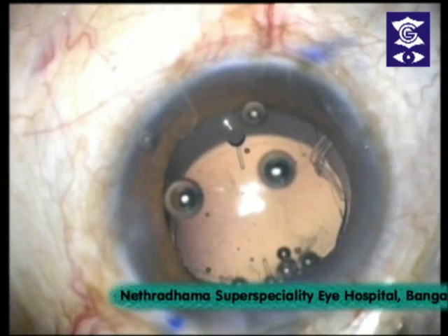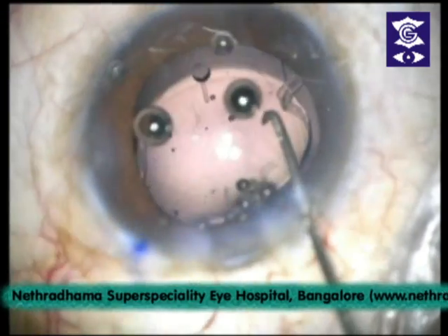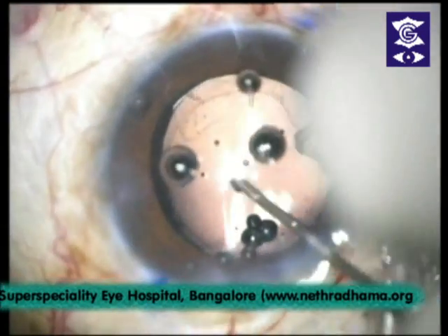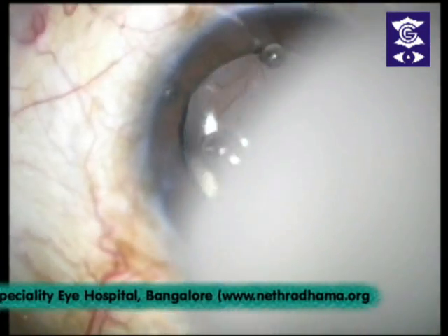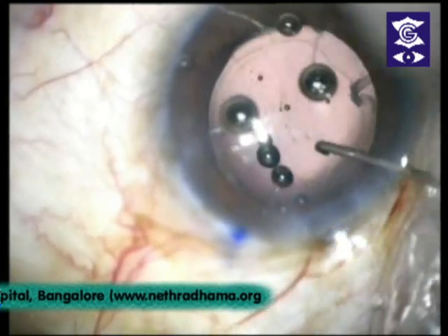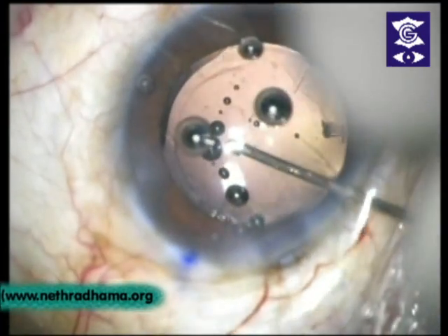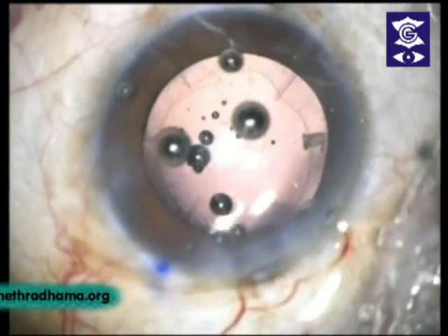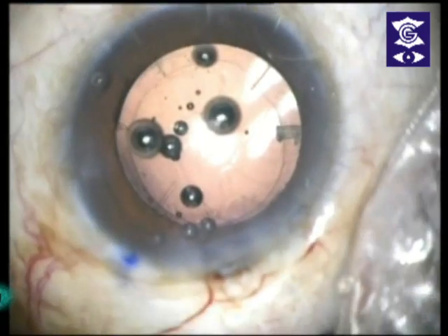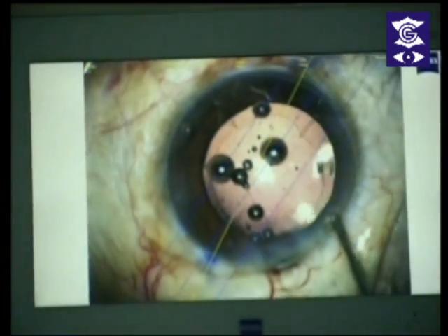This is the injecting done using the wound assist technique. You can see the lens going into the bag comfortably. I'll tuck the lens in and rotate it to coincide with the blue axis. Lens is here — you can see the axis marking. I'll rotate it. Now you can see that the lens axis coincides almost accurately with the blue line.